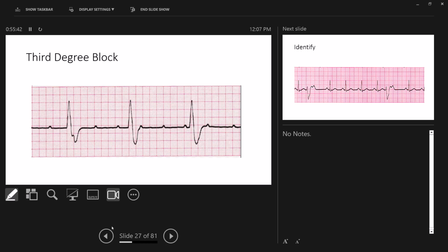Travis. That is ST depression. We will learn more about what ST depression means in advanced cardiology. Now, here's the thing to remember, just a little bit of a tidbit of coming attractions: we're only seeing this in one view. In order to conclusively identify whether this is actually ST depression, we've got to run a 12 lead.